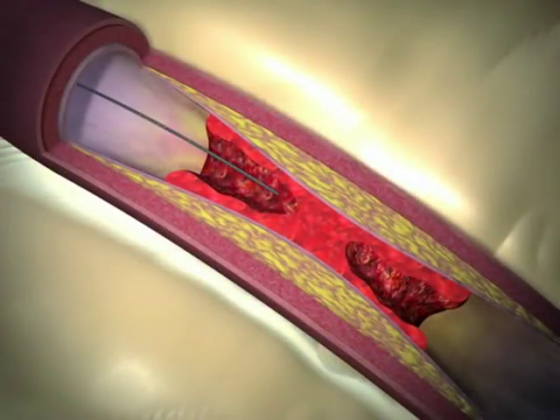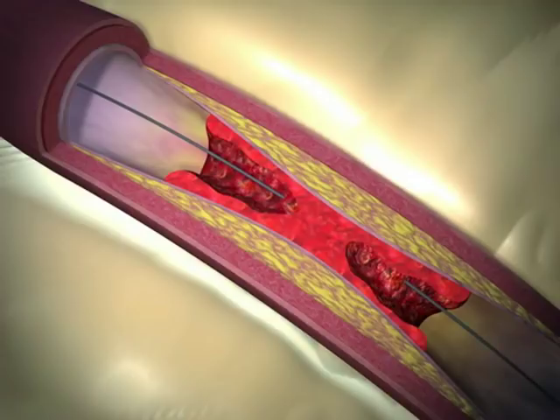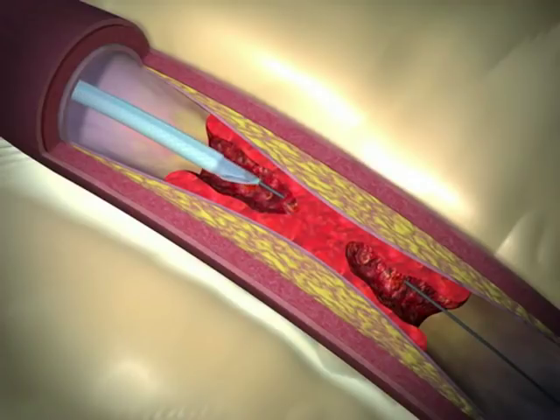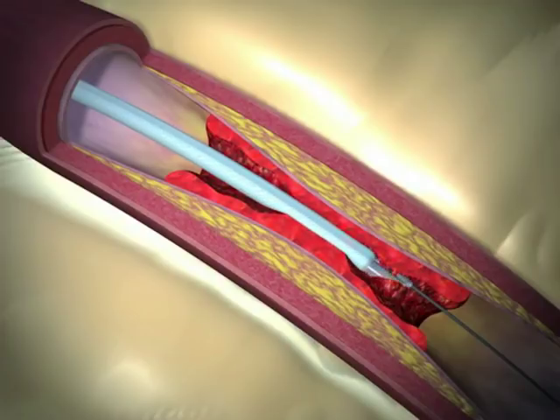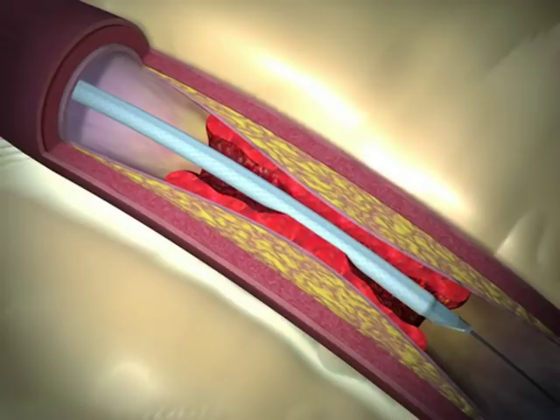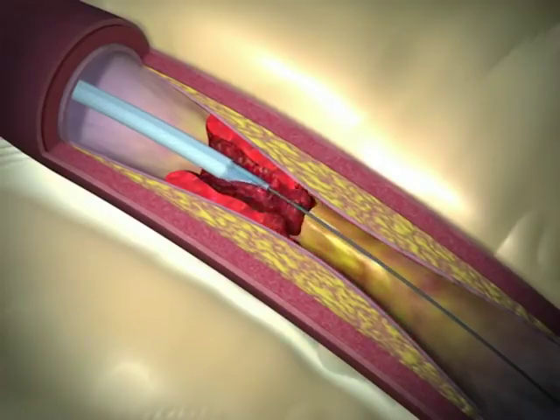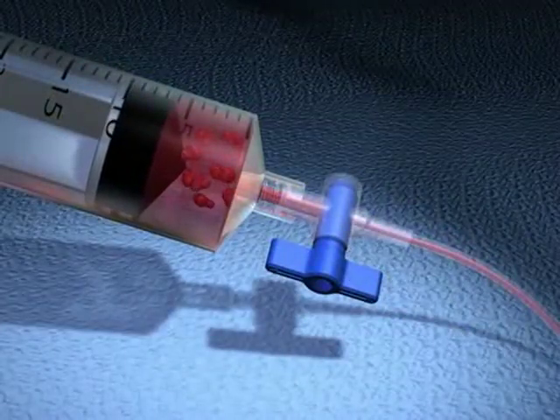In the aspiration technique, a guide wire is passed through the occluded artery associated with the infarct, and a small catheter is advanced into the occluded segment. Direct aspiration of the occluding thrombus is performed by withdrawing the catheter through the clot while extracting the thrombus material into a syringe.